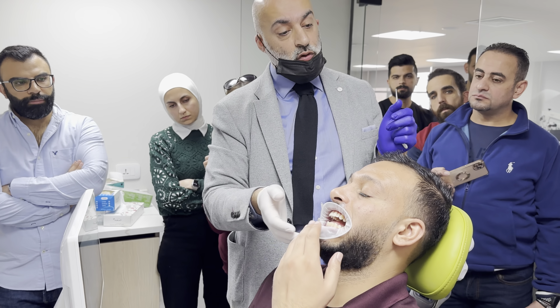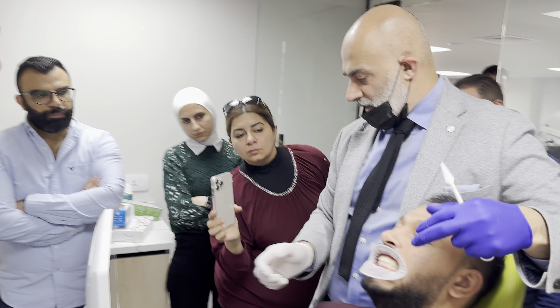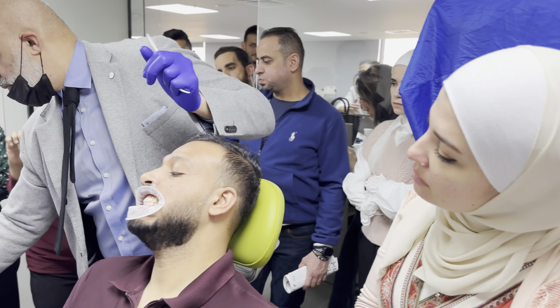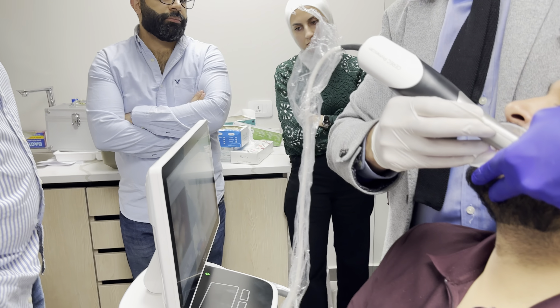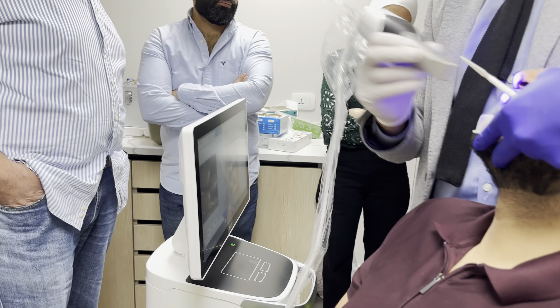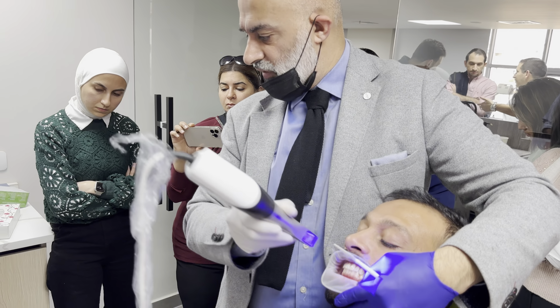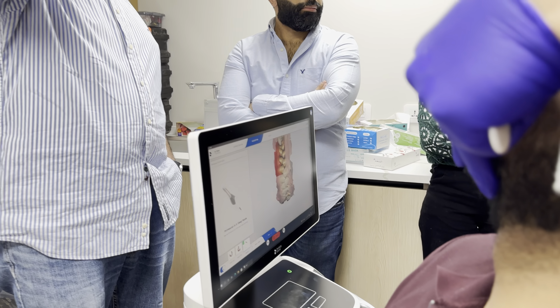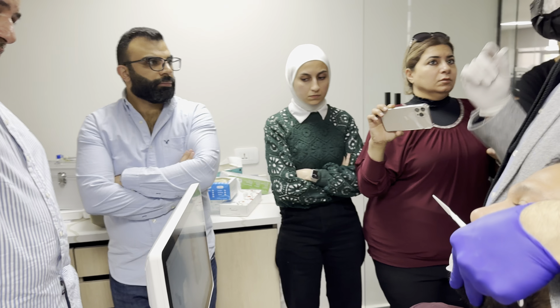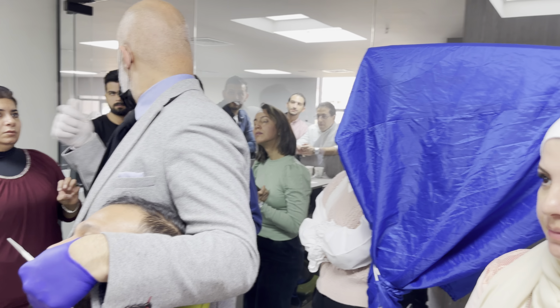Not to clench, just bite together so the teeth are touching. I go straight to the pre-molar — stay biting now. Each side, I do the pre-molar of each side. If teeth are missing, there's no need to bite in front of the teeth. I always do the equilibrium thing — if missing, I put the wax rim in and you can do the bite that way.